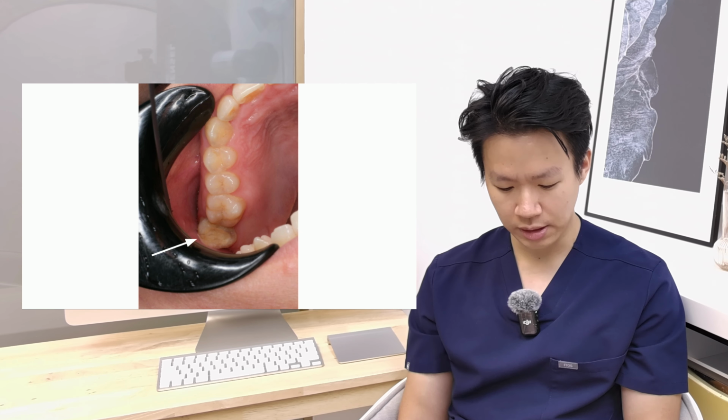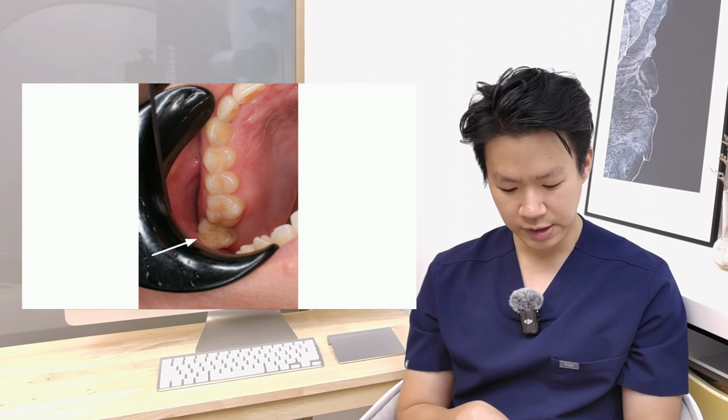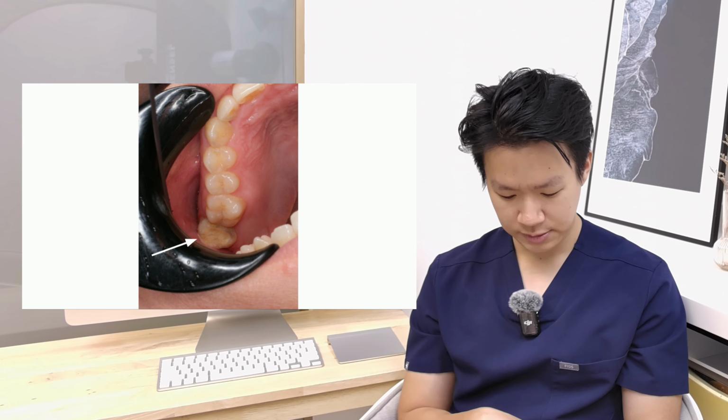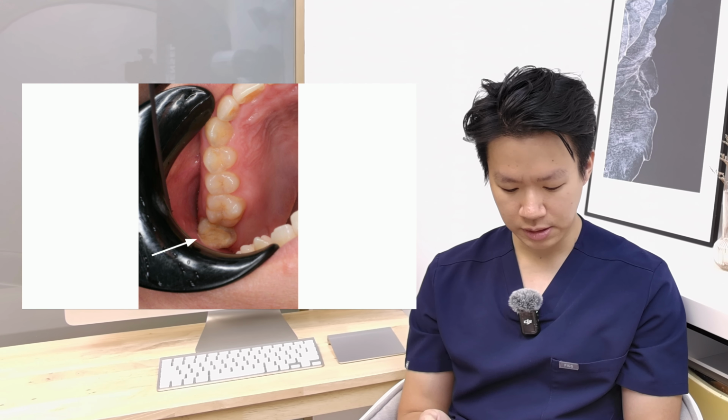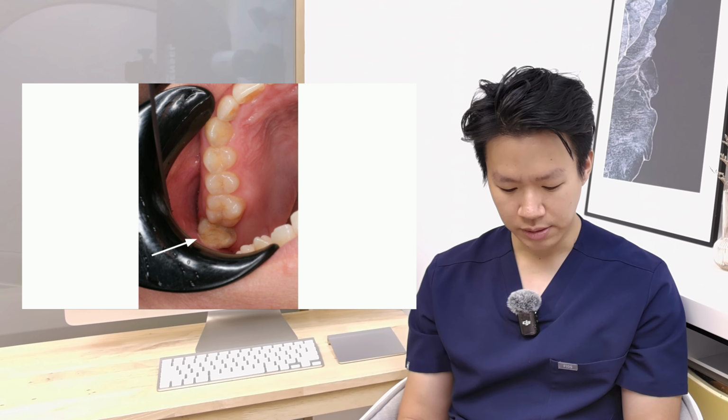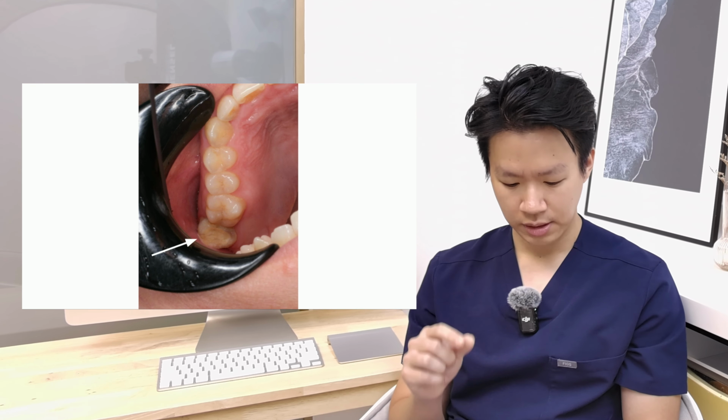So this is what it looked like intraorally. As you can see from the arrow here, the tooth that the patient was complaining about was on her upper right, the last tooth on the upper right. Right off the bat, this particular tooth doesn't look the best. Why do I say that? Because you can see there's a very large filling material on the surface of the tooth, and the tooth also appears to be rather short, and there doesn't seem to be a lot of actual tooth structure remaining.